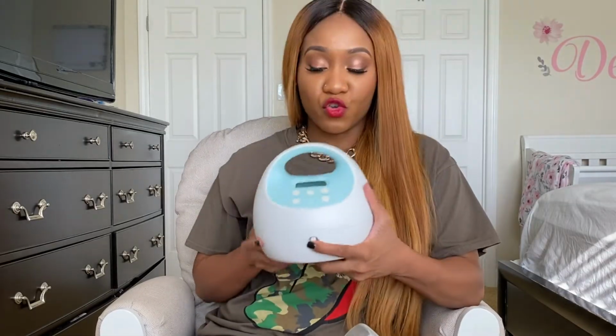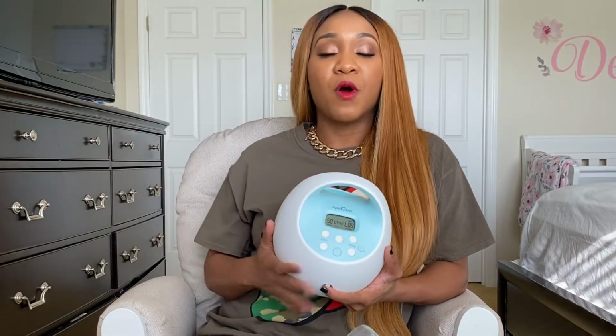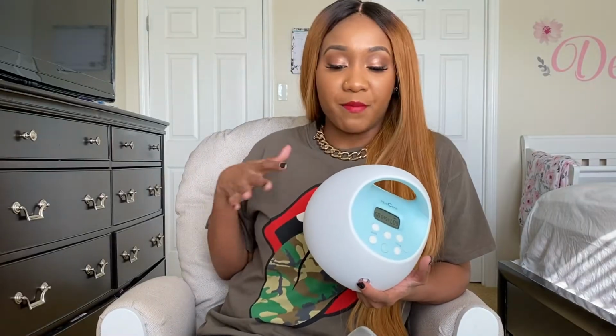Once you're in letdown mode, you have different cycles. Honestly, I don't think it really matters what cycle you're on. What's important is that you're in this mode. What you can do is, once your letdown slows down or you don't see your milk spraying out, switch back to massage mode for another 1 to 2 minutes to stimulate your breasts some more. Then once you get that letdown, switch back to letdown mode, or you can just stay on letdown mode. But it's important that you get off of the massage mode so that this pump is properly suctioning all of your milk out.